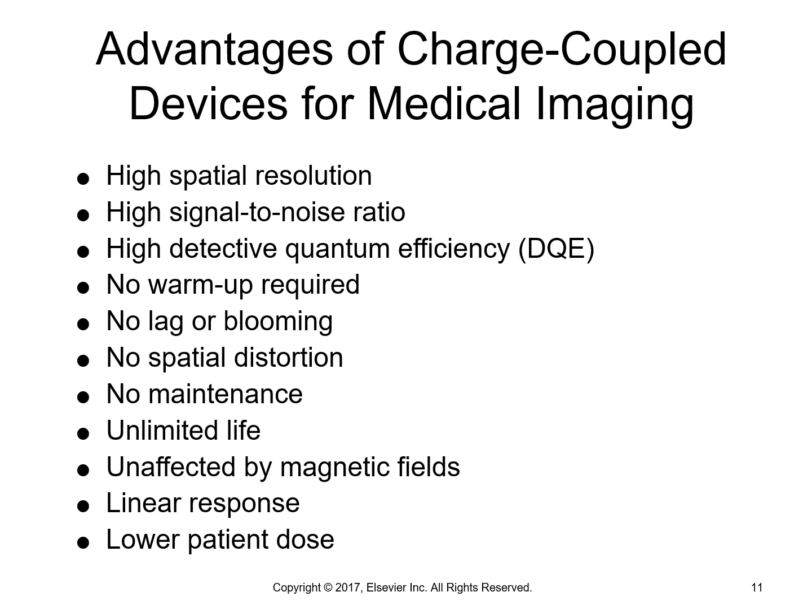Okay, so there's no maintenance to a CCD, and even if there is maintenance to a CCD, it really is just pull the machine apart, pry up the CCD because it's got connection prongs to a circuit board. So undo all the solder points, pry it up with a pair of tweezers, and replace it with a replacement CCD, and then solder it back to the circuit board. If you want to go through that trouble, it's extremely cheap to build a CCD. The components are pennies to make this thing. So there's oodles and oodles of them just sitting in warehouses waiting to be installed in digital cameras. It's not worth the effort to replace or maintain a CCD as a component.